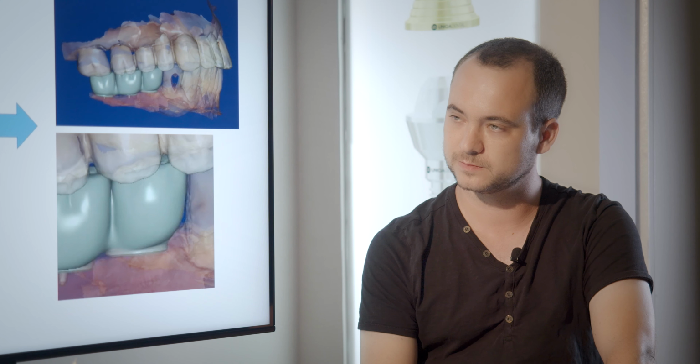This way you save another appointment. You don't need to retake impressions. You don't need to call the patient again. You save time. It works perfectly. The only problem is you need to have the information of what type of multi-unit you used, and what height. The information that goes from doctor to technician and vice versa is really critical at this point.